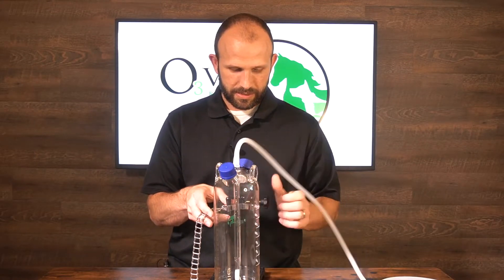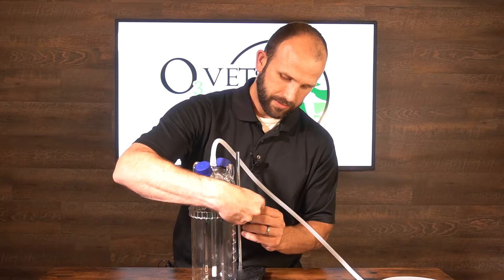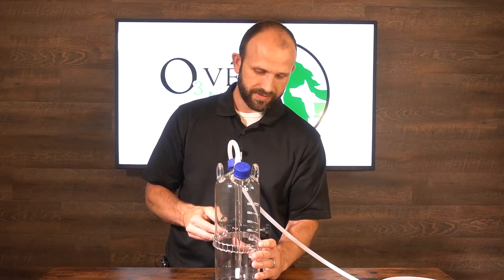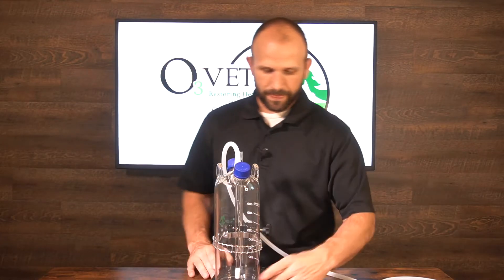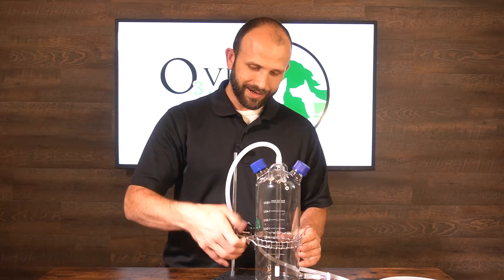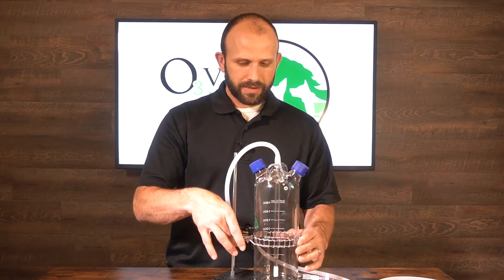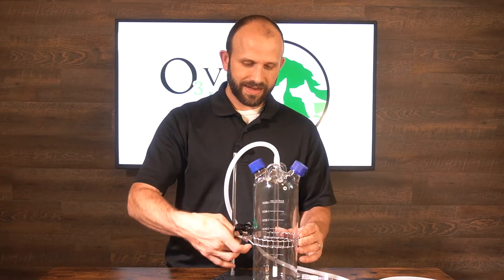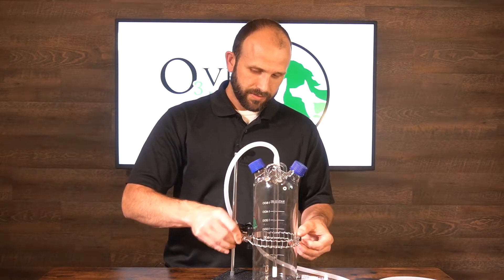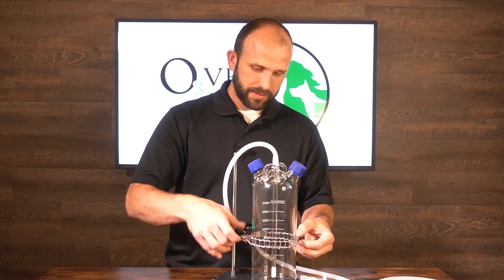Put the bubbler back on, wrap the chain around, and hook it on the other side. Lower the bubbler to a good height, then snug the chain up by turning the wing nut. Keep your fingers on the chain so you can feel when it's tight — you don't want to over-tighten it since it is glass, but it shouldn't really move once you're done tightening.